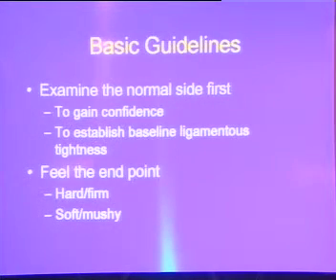I always try to examine the normal side first, number one, to gain confidence of the patient, and number two, to establish basic ligamentous tightness in that particular patient, and try to assess the end point.